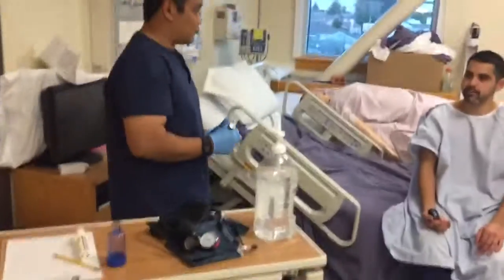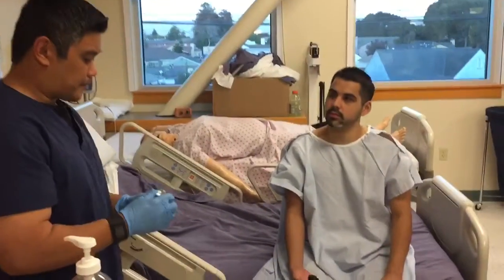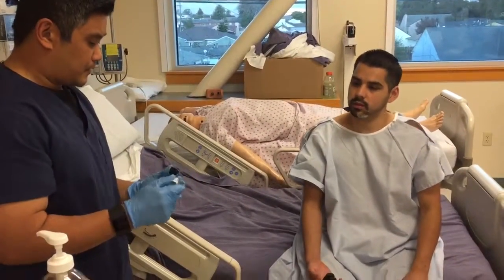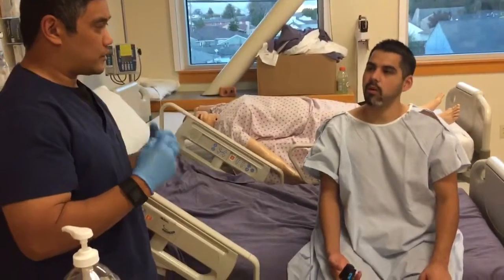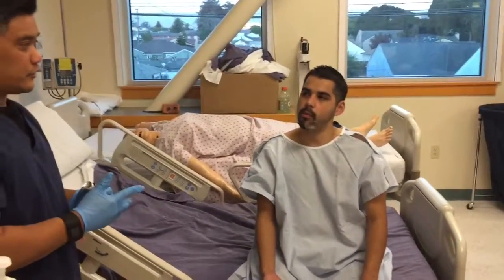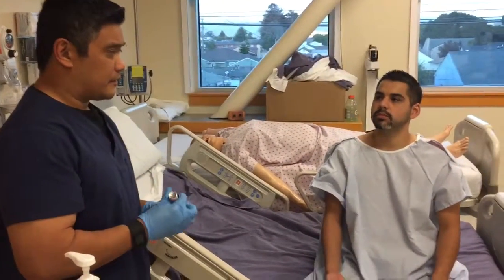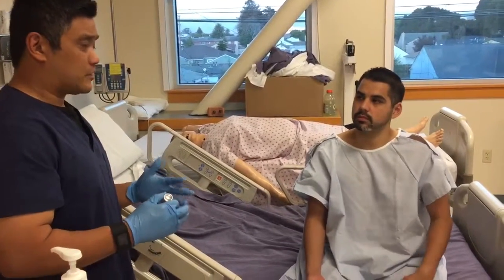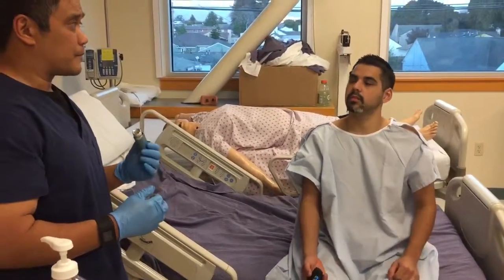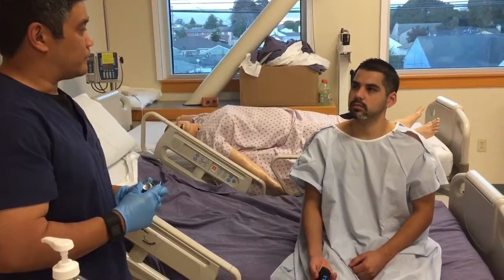All right, from here we'll go ahead and do the metered dose inhaler. So this is a device for you. It has albuterol in there, and essentially it's a medication that will help open up your lungs, your airways. Right now it's probably a little bit constricted, restricting your flow a little bit. So this would get it to where it needs to go, open it up. There is a bit of a side effect. It makes you a little bit jittery. It might increase your heart rate a little bit. This is completely normal. If it does become uncomfortable or worrisome, just let us know, and we will see what else we can do. We'll have to change it up a little bit.